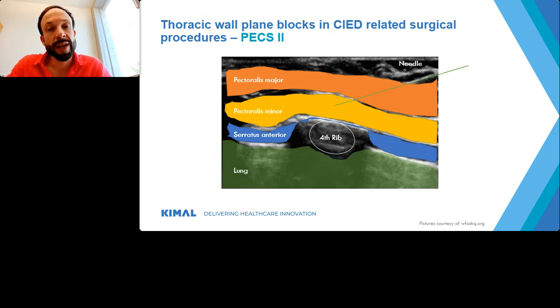Pneumothorax could be a side effect. So really important is to be watching the whole procedure live with your probe when you're advancing the needle towards the final structures where you want to infiltrate with your local anesthetic.